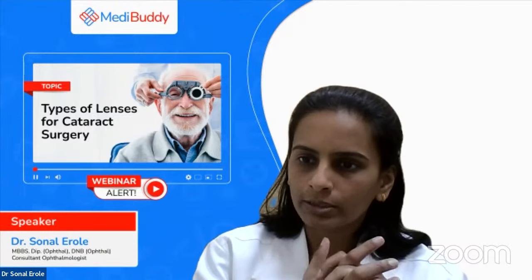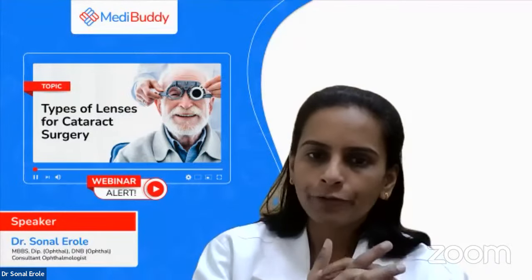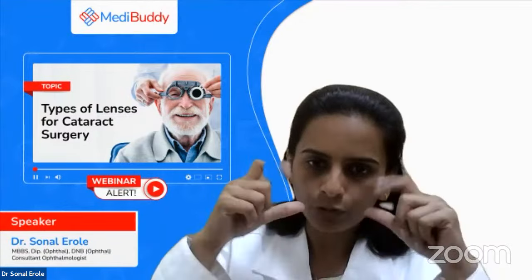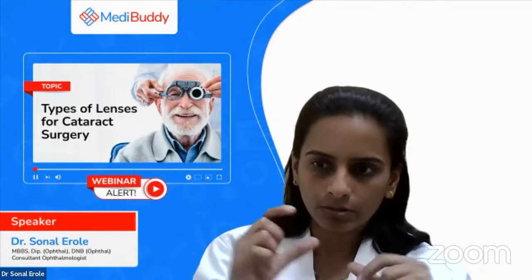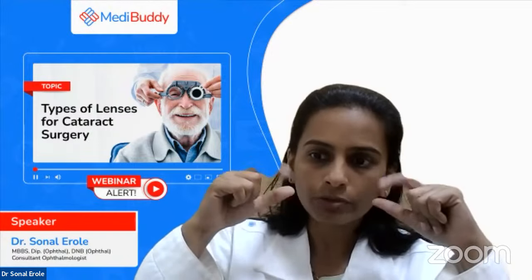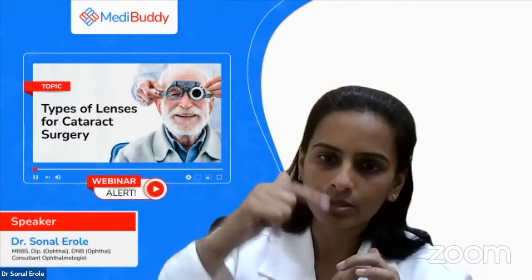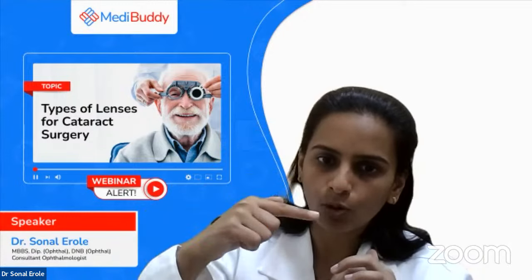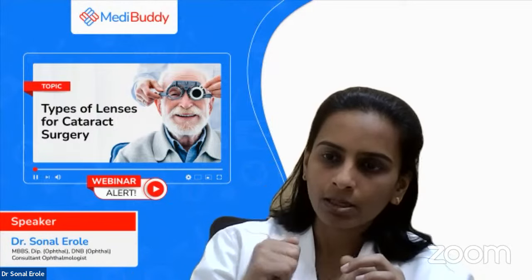Which progressive lens should be used? Progressive lens is basically a concept for the glasses that we use. These are called progressive lenses, which have a power gradation from above to down: distance, intermediate, and near.